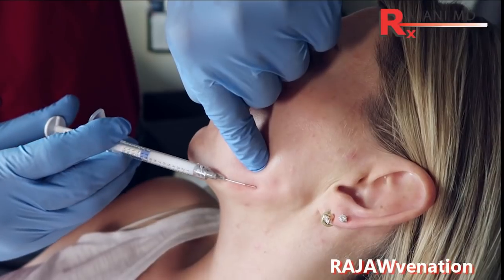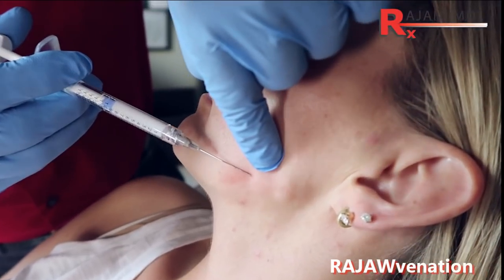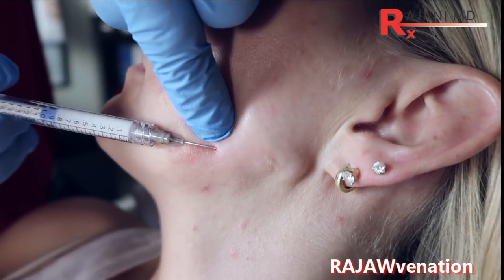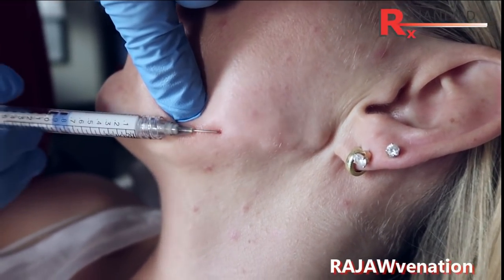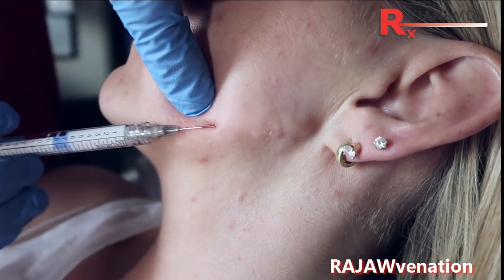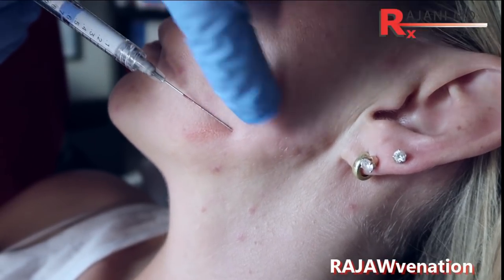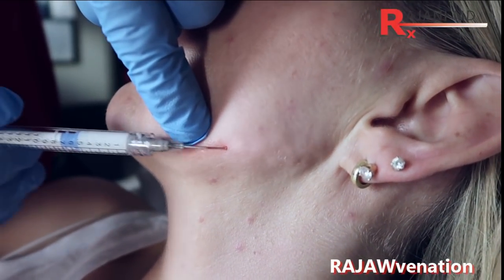I'm really aiming for the angle here, but remembering that the opening of the cannula is proximal to the tip — it's not exactly at the tip — so we have to account for that and overshoot a little bit. You can see we're creating volume just in front of the ear. You could come down and really create more of a jaw, but in this case we're just recreating what was lost in fat and bone, then coming down just inferior to the jaw, always knowing where the mandible is so that we're keeping the line straight.